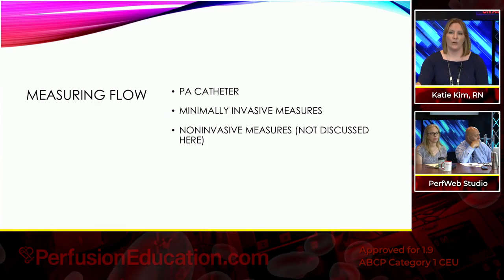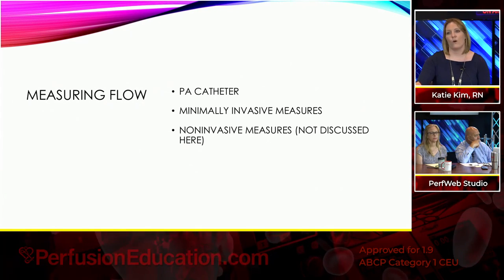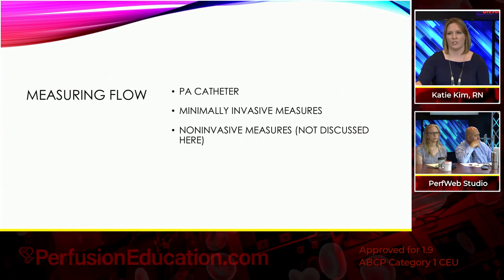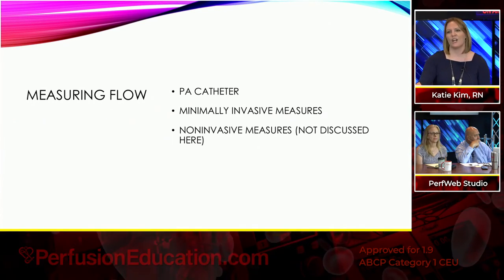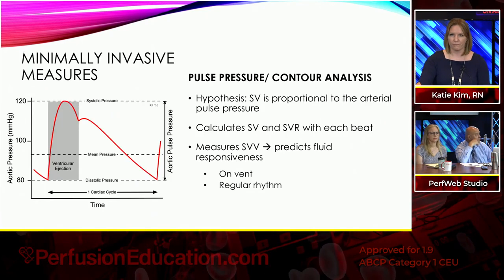How do you measure the flow? You can do that through the PA catheter, like I said. Or there's also minimally invasive measures that I'll touch on a little bit. And then the non-invasive measures, which I'm going to leave for Tammy to discuss, to determine how you are going to measure your cardiac output.